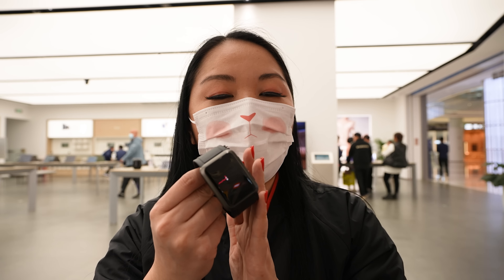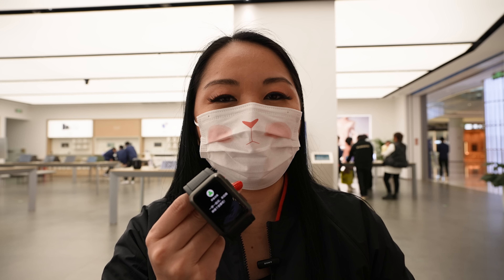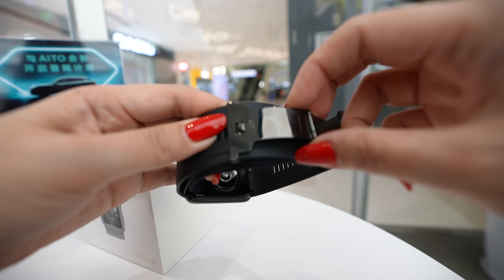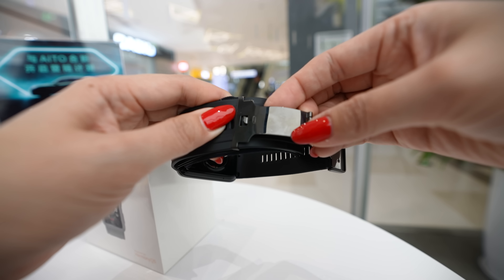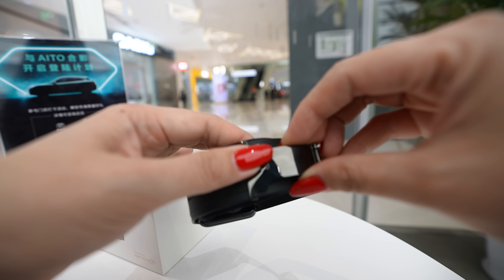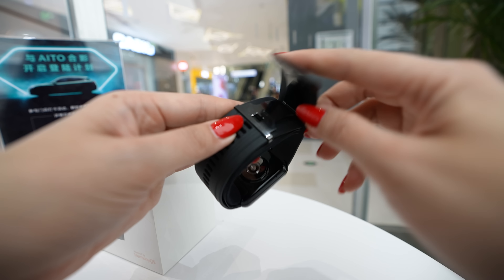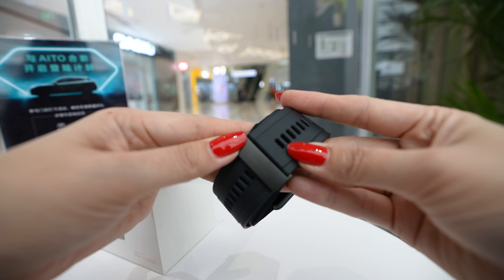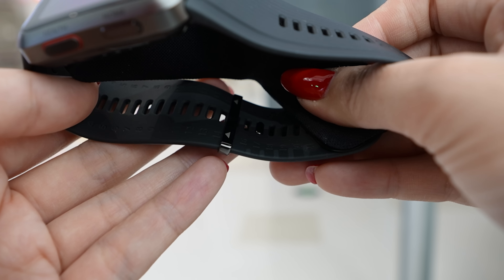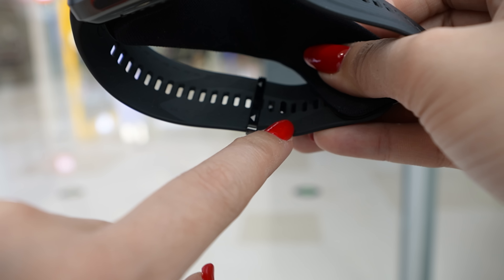The same day they announced the Huawei Watch D, they also announced the Huawei P50 Pocket — if you haven't watched that video, give it a check because it's very interesting. To adjust the strap, it's super easy: you push it a little bit to get it out of the hole, then position it where you think fits, and put it in the next hole and close it. You don't need to cut anything. In the hole there is a measurement guide that corresponds to the sizing thread that came inside the box.